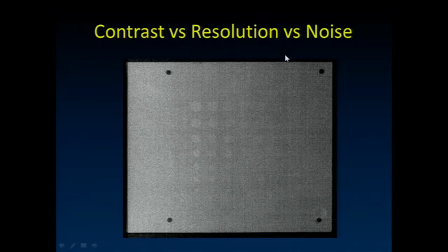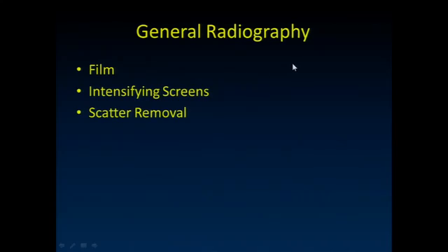Certainly we can make that much better just by driving down the noise. But of course that means more photons, right? That means greater dose to the patient. So I want to talk a little bit about general radiography. I'm going to just mention film very briefly before I move on to digital imaging.